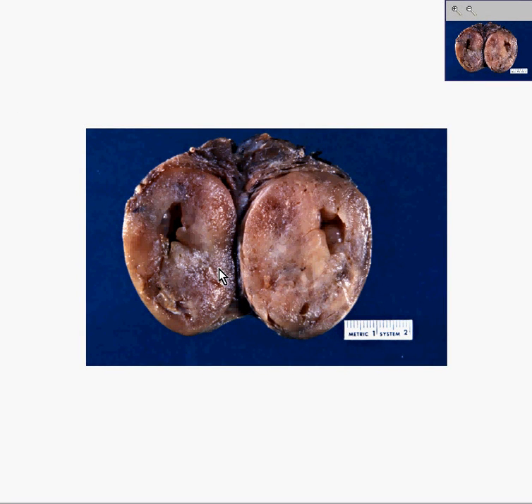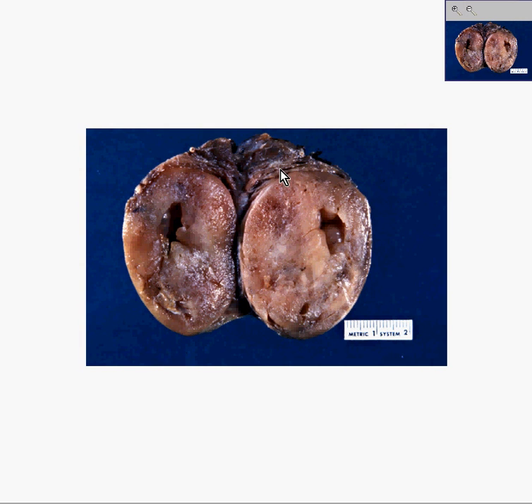Here is another thyroid. You could see a large nodule, four to five centimeters, cut in half and separated rather nicely and precisely from the surrounding normal thyroid tissue, which is over here.